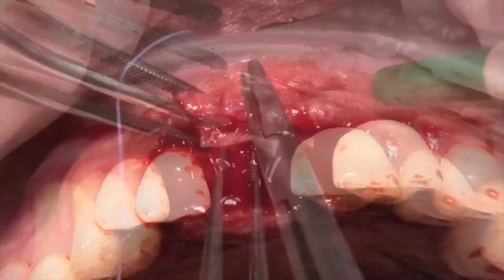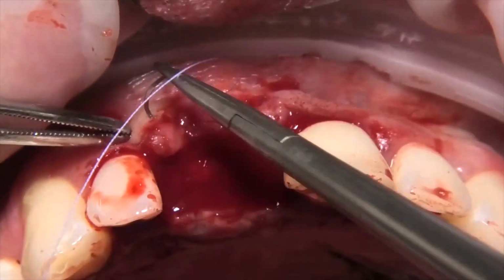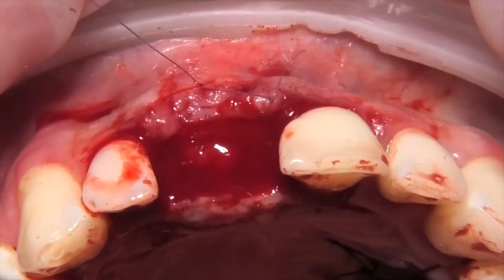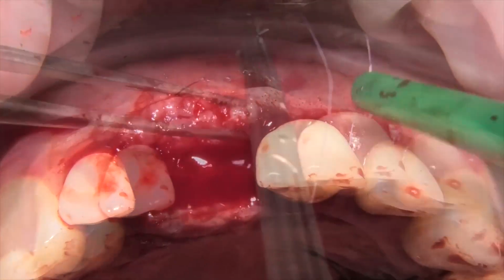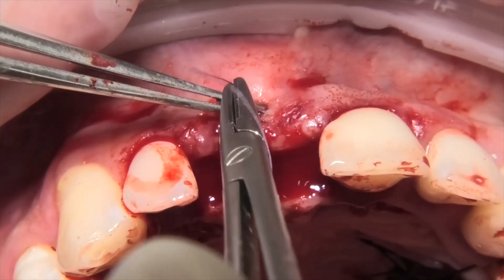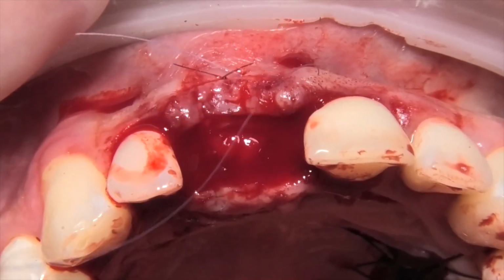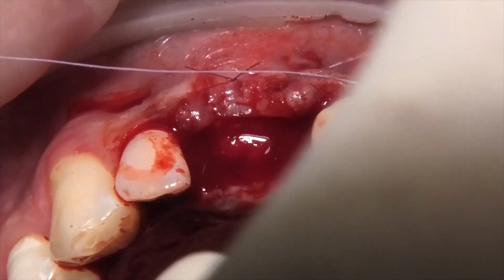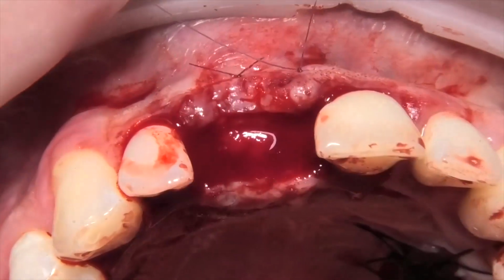The membrane is then tipped onto the vestibular side, and once wet with blood, it adheres well to the surrounding bone plates, and it's positioned well on the vestibular and palatal. And now we are ready to position the connective tissue graft, which is inserted and blocked coronally on the vestibular flap, so as to increase the thickness and height of keratinized tissue. The graft is blocked with 6-0 absorbable polyglycolic acid sutures in an external horizontal mattress.